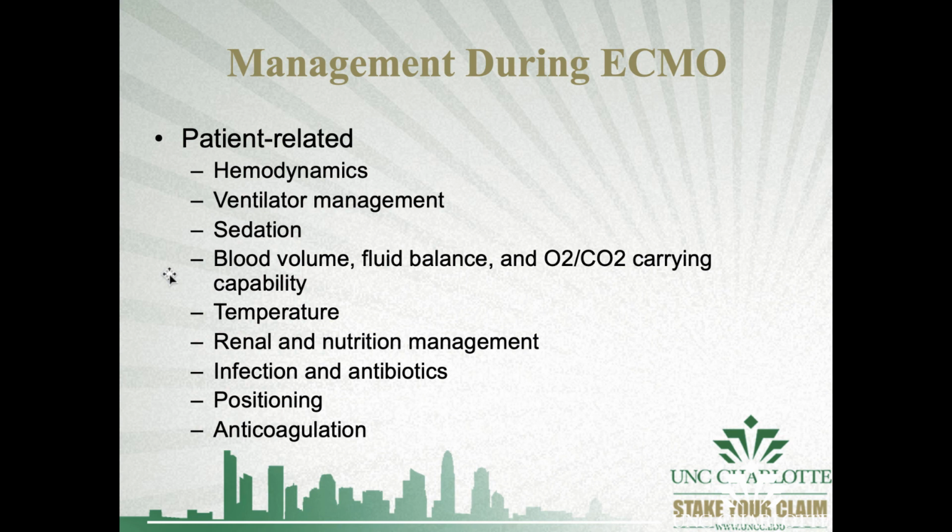You also want to look at, we're going to leave that alone for a second. Temperature regulation is very important with ECMO. You have a lot of their blood outside of their body, meaning that it needs to be heated. Okay, so we have to maintain the patient's temperature. We have to maintain normal physiologic range for their blood.